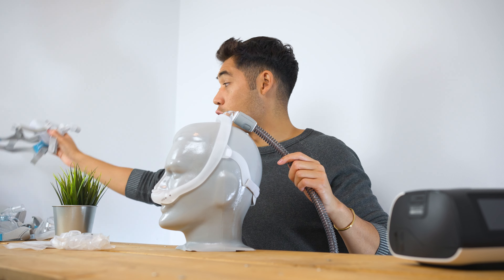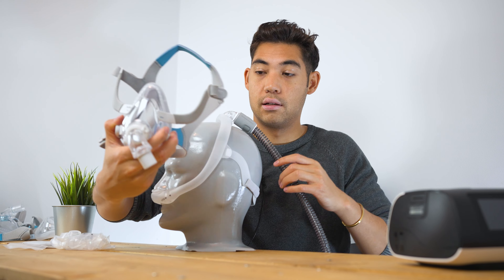Hi everyone, welcome to cpapstore.ca. My name is Tristan. Today we're going to be looking at the Philips Dreamwear Pillow Nasal Mask.